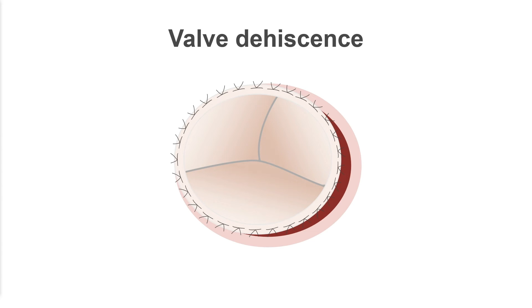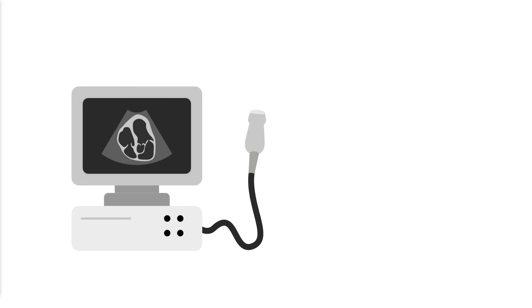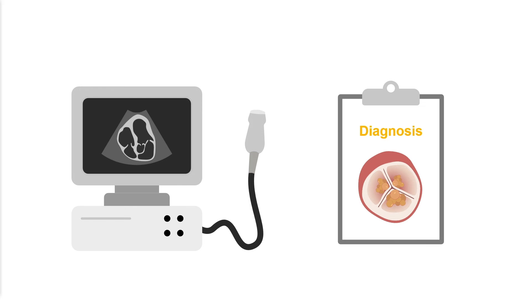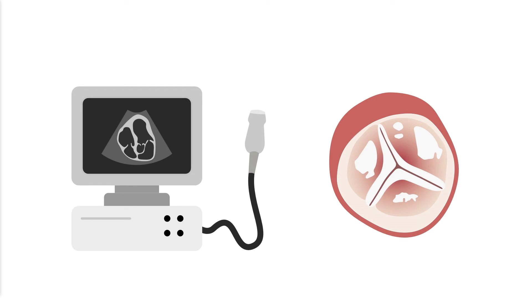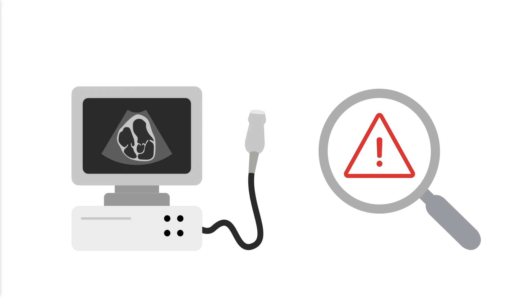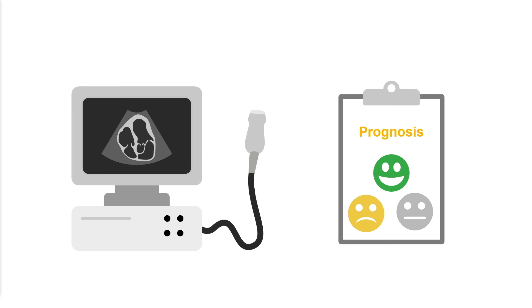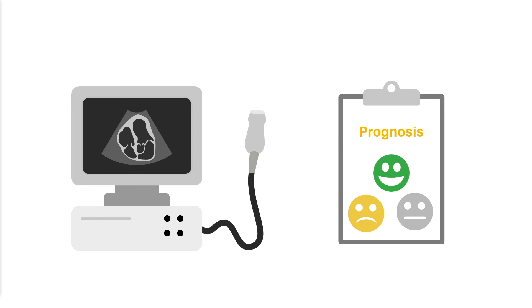Valve dehiscence is evidenced by the presence of paravalvular regurgitation, indicating that the edge of a prosthetic valve has started to come loose from its suture line due to infection in that region. Beyond establishing a diagnosis, echocardiography can also provide information about pre-existing abnormalities, help identify complications, assist in prognostication, and predict embolic risk.